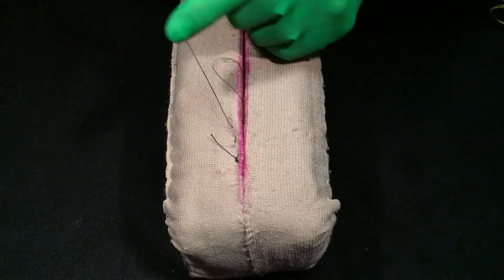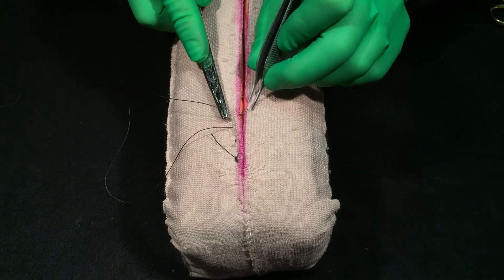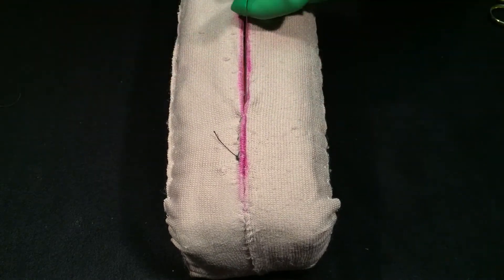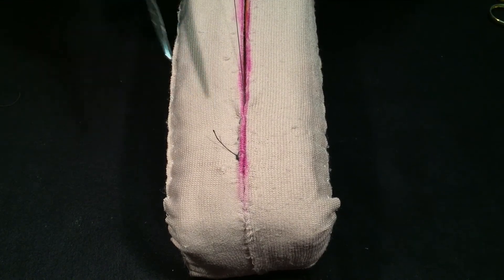One more just to get it in your head — you can pull the skin and get it right near the edge. And there you have it: the nipple side and the skin side, with only one side where you see the stitches.